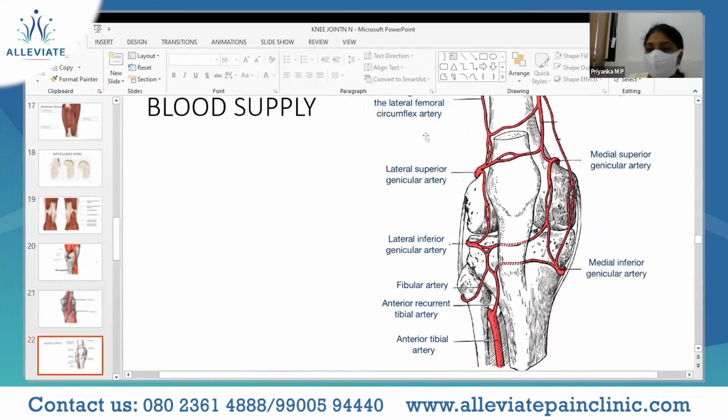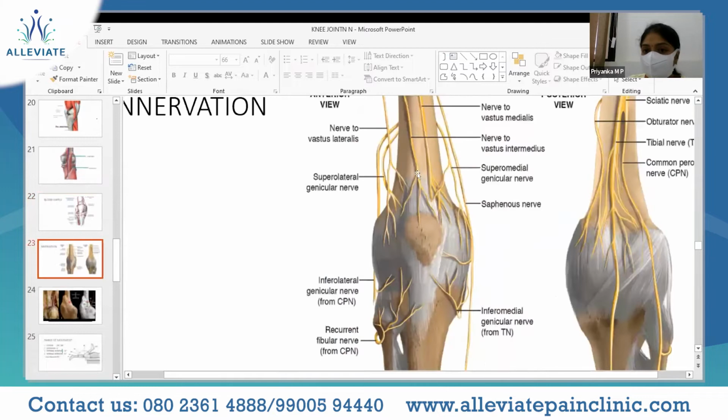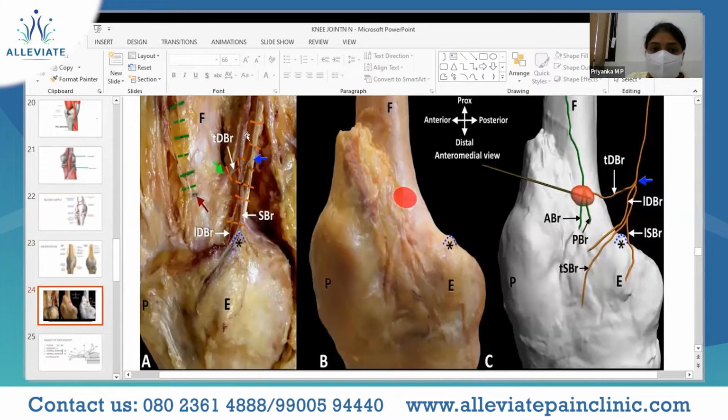Coming to arterial supply, all the genicular arteries are formed from the popliteal artery, and they extend intraarticularly and also travel along with the genicular nerves. As we see in this one, the genicular nerves travel along with the genicular arteries.